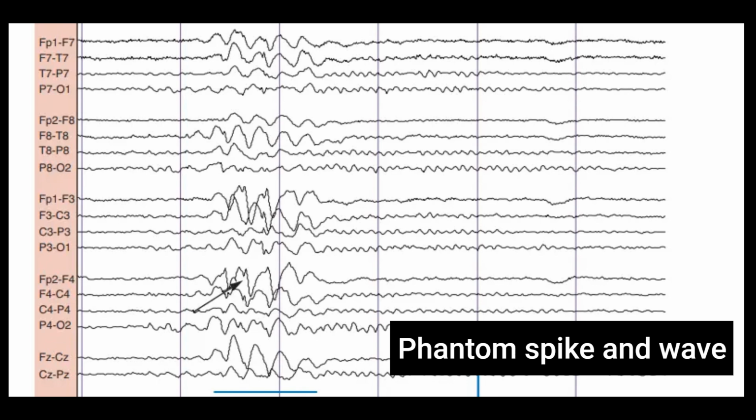Totally harmless, yeah. What's interesting about them is that the spikes themselves can actually be less prominent than the following slow waves in this pattern. So it's like the slow wave is the echo of the phantom spike. Exactly. It's like a phantom echo.